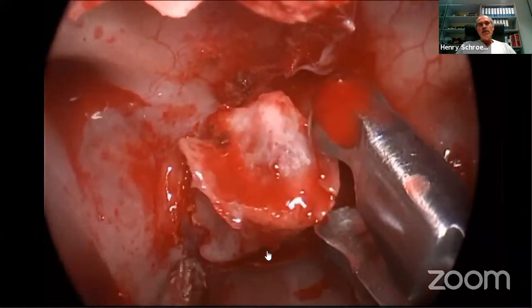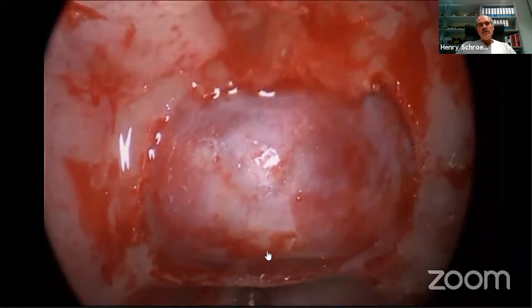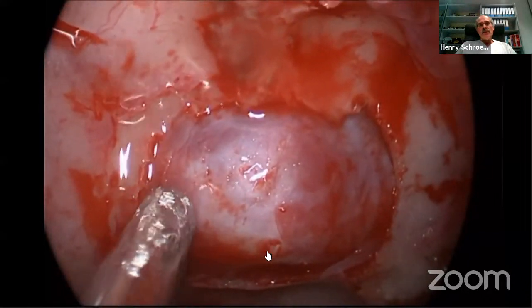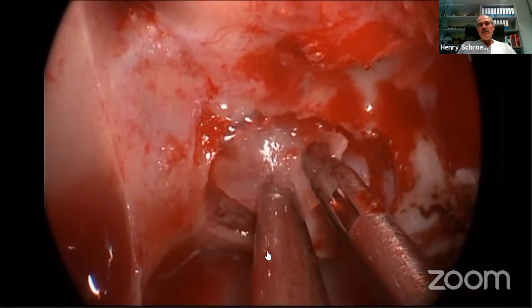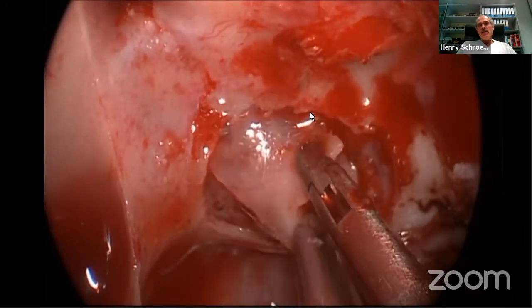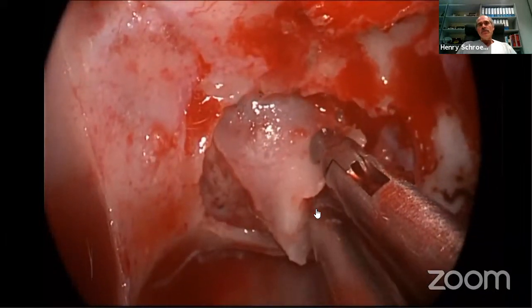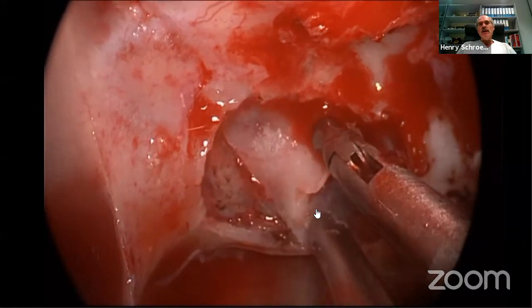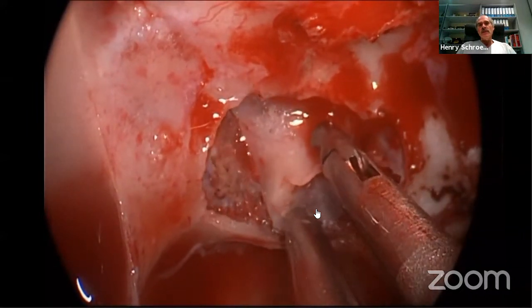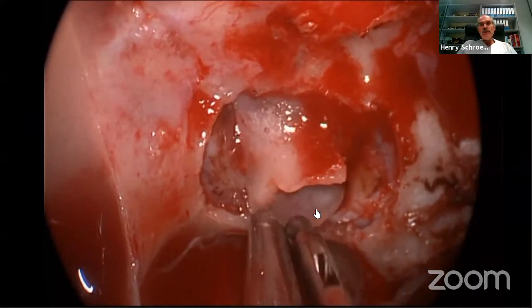But in small microadenomas, usually you can preserve the bone. After tumor resection, I bring it back, turn it 90 degrees, and it is wedged under the bone of the margin of the opening. Some people say it's not required. It's okay; CSF leakage is very unlikely because the diaphragm is thick, but I like to reconstruct the bony floor as well.